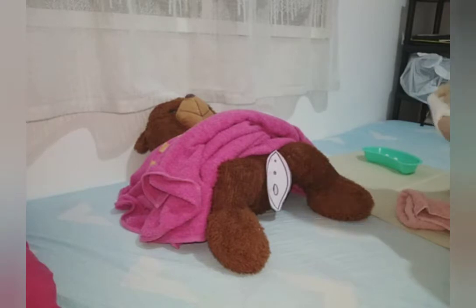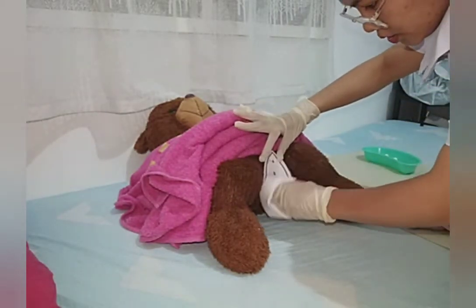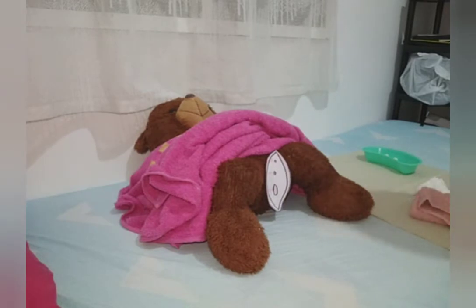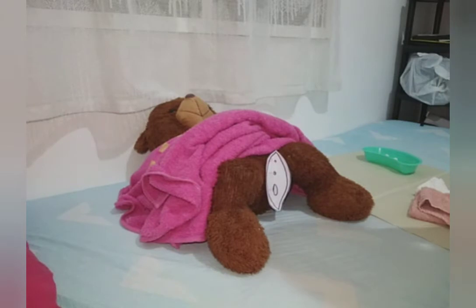Now I will dry with the hand towel. It should be dry and clean. Make sure it is dry. Now I'm done cleaning the perineal area of the client. Now I will take off my gloves and perform hand hygiene again and prepare for the next procedure.